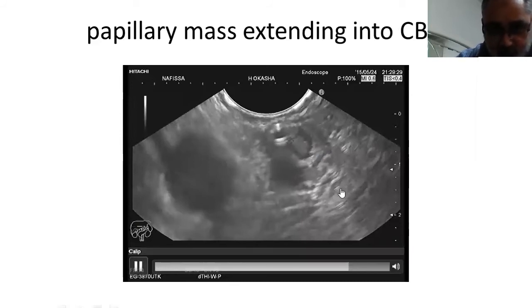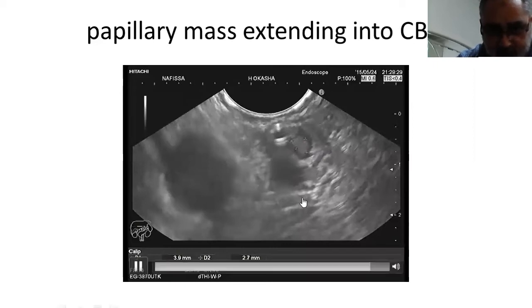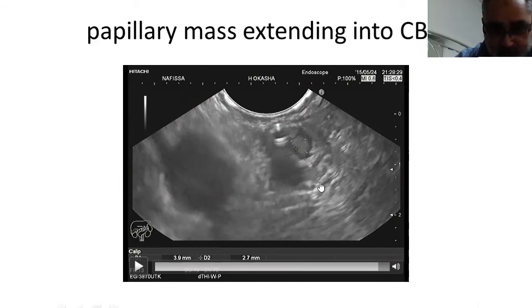In order to do endoscopic ampullectomy, there should be four prerequisites. First, the papillary mass should not exceed 3 cm. The intraductal extension should not be larger than 1 cm — here it is 2.7 mm by 3.9 mm, so it is less than 1 cm. The mass itself should be less than 3 cm. It should respect the deeper muscularis propria layer — no invasion of the muscularis propria layer. And the biopsy should not show severe dysplasia, carcinoma in situ, or adenocarcinoma.